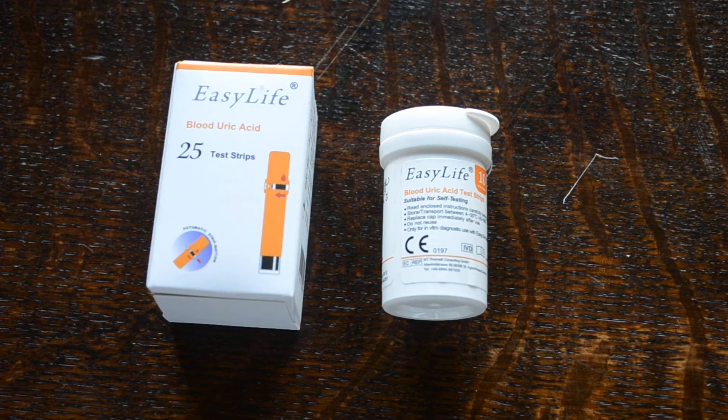Welcome to this video presentation of the EZLife blood uric acid test strips. The EZLife meter system has to be bought separately to use these test strips — these are intended as refill packs for people that have pre-purchased the meter. EZLife is a triple detection meter, so when you buy the meter you have the ability to use test strips that test for uric acid, cholesterol, or glucose.